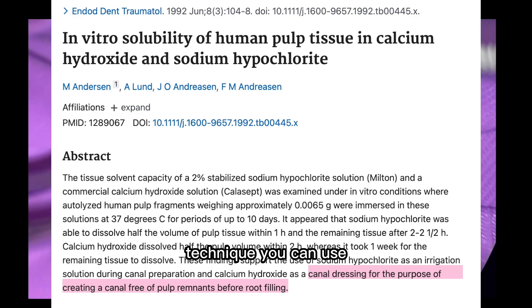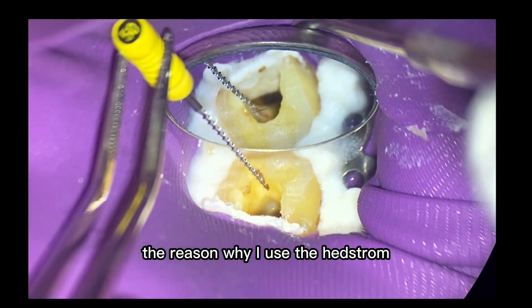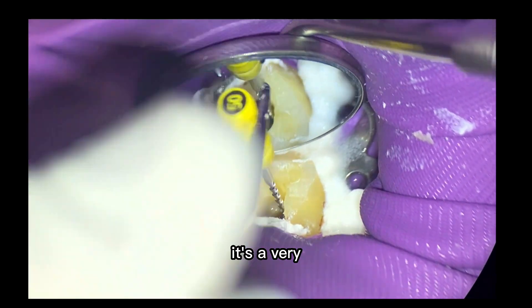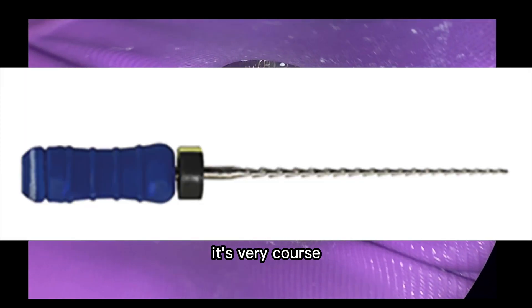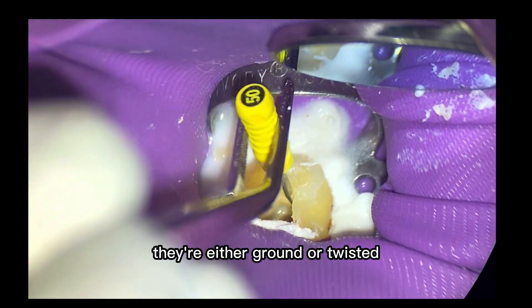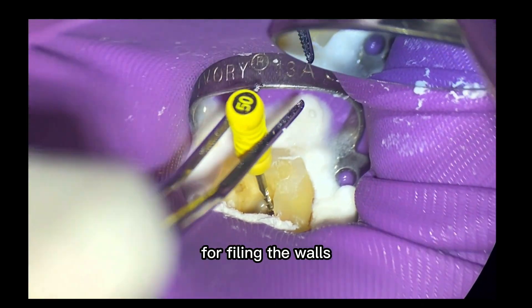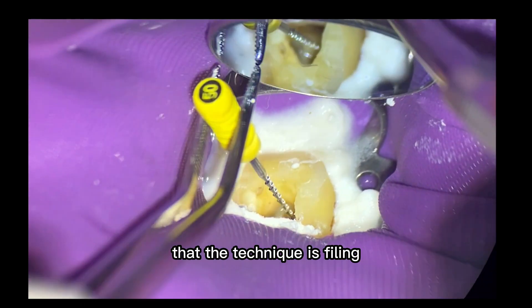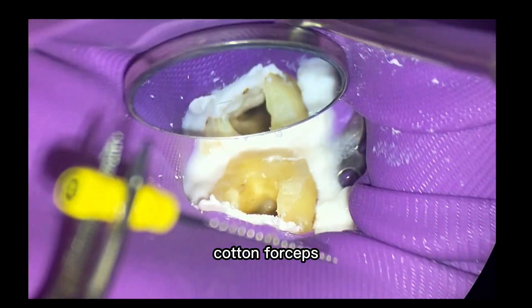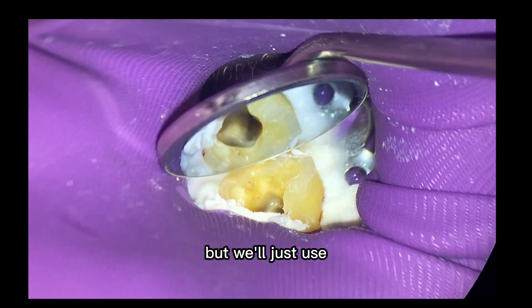So that is one technique you can use, and then we'll irrigate all that out with our sodium hypochlorite. The reason why I use the Hedstrom, if you're asking that question, is because it's very coarse — you can see the flutes. It's very coarse compared to a regular K-file, which is either ground or twisted. This is a ground file and it is really aggressive, so it's perfect for filing the walls. The technique is filing, and I'm using my cotton forceps just to get a better picture.